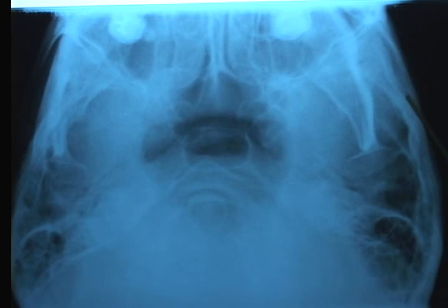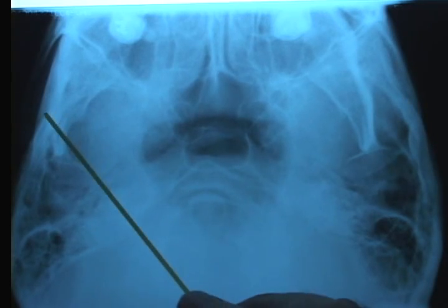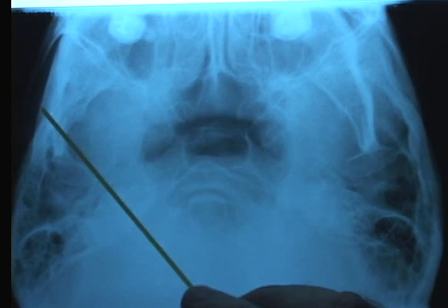And you can see that it is inset quite a distance, whereas on the other side, it almost is superimposed on the outside of her head. Also, you can see that this side of her head is more normally rounded than is this side, which has been flattened. All of these are cranial compensations to the displaced disc.